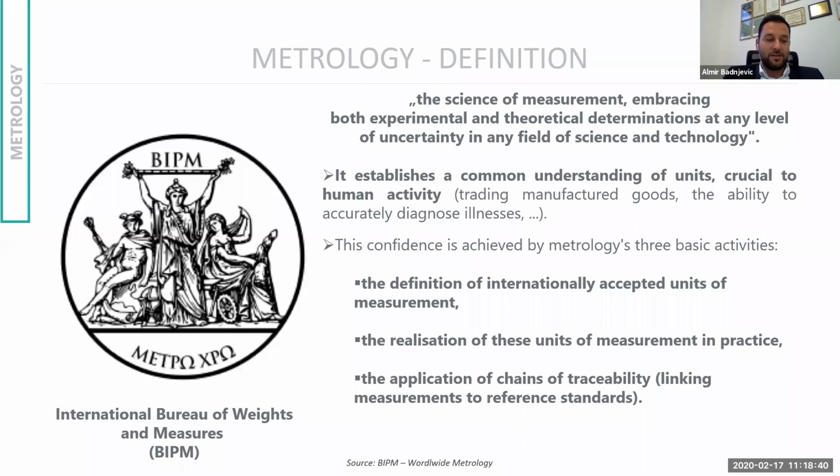Then the second activity of metrology is in fact the realization of SI units of measurement in practice. And the third one is the application of the chain of traceability. It means linking the measurement to reference standards in each country, up to national and international ones, where each country must have some kind of traceability with international standards.